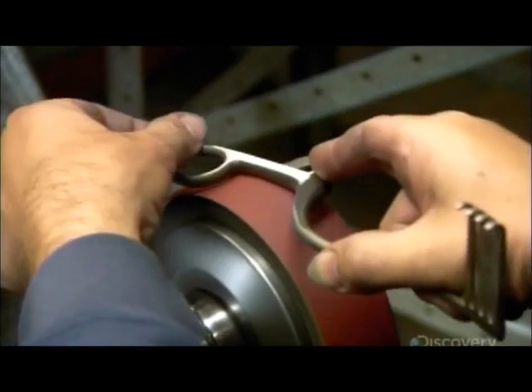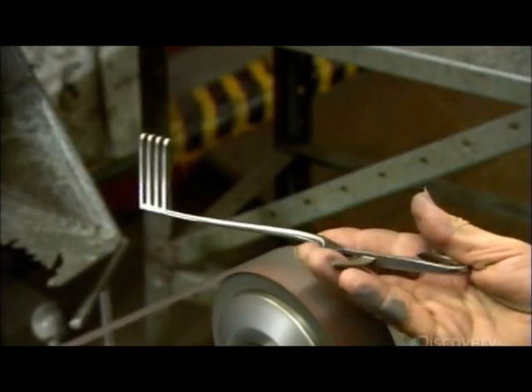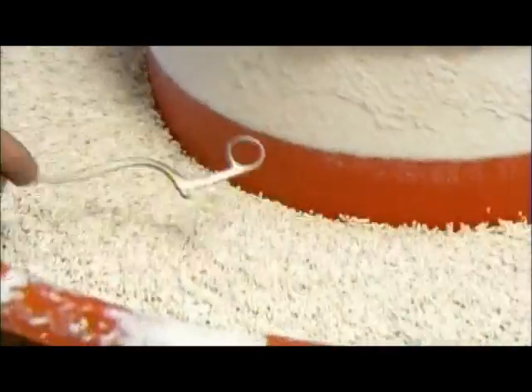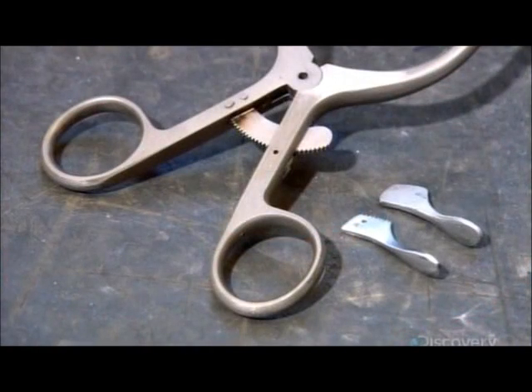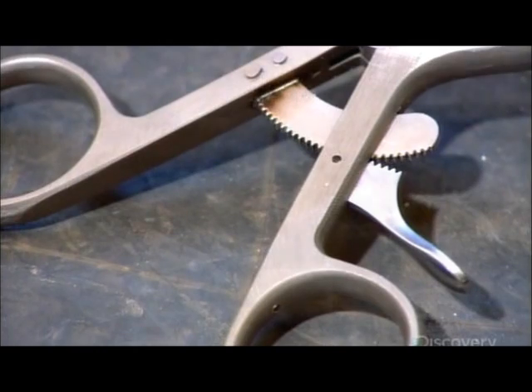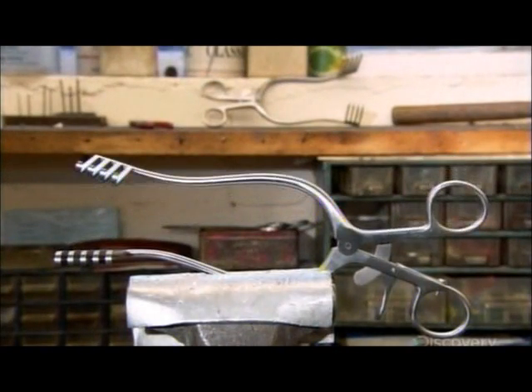After heat treatment, a worker sands all the tool components to smooth, sharp edges. Vibrating porcelain chips and polishing compound scrub them clean and remove burrs caused by machining. Next, they install the pivot screw and trigger for the rack. By pressing it, the surgeon can open the prongs to the desired width and lock the tool in position.